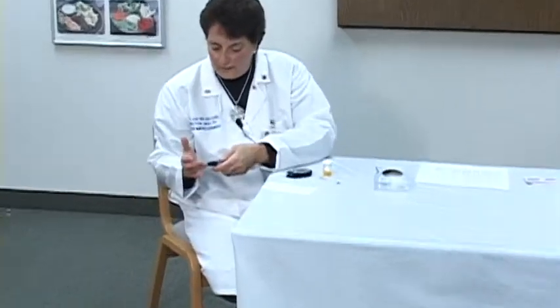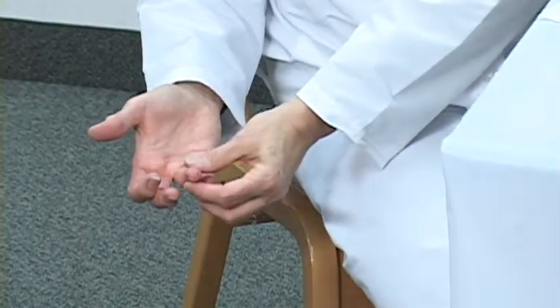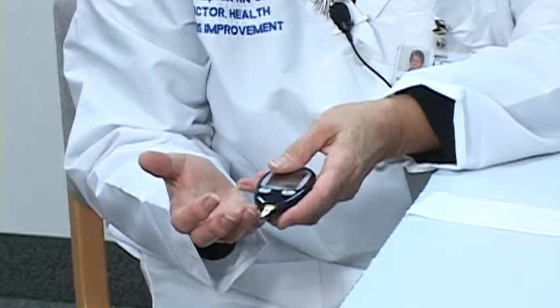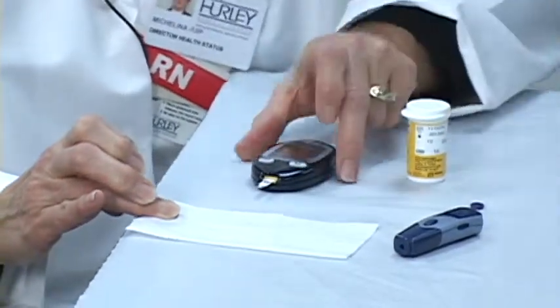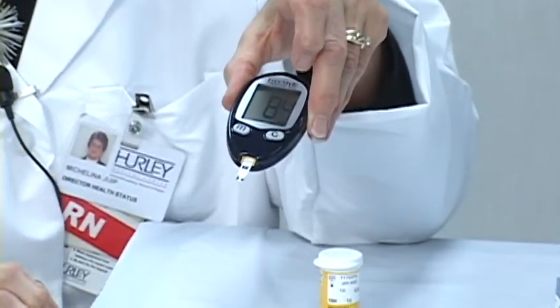I put my hand down to ensure that I get a good blood sugar flow, poke it, and then simply bring the blood to the strip. When there's enough blood on the strip, it will start timing and provide me with a blood sugar result. In this instance, my blood sugar is 84.